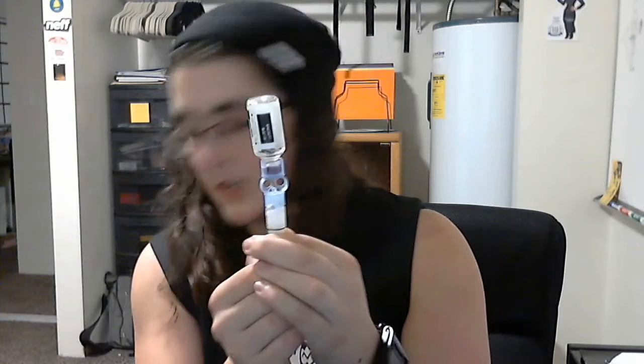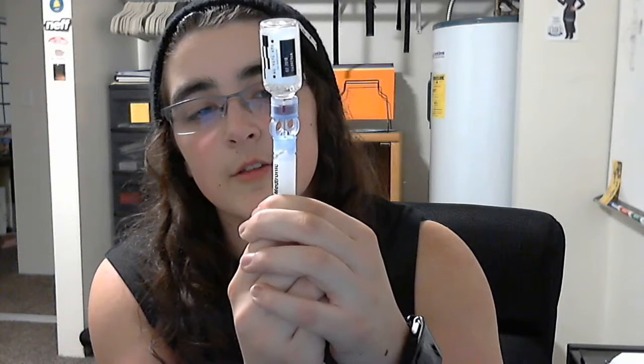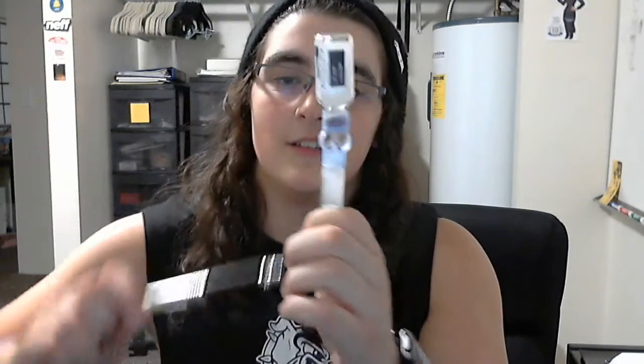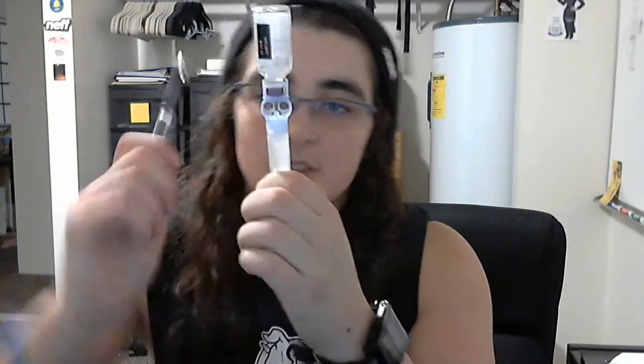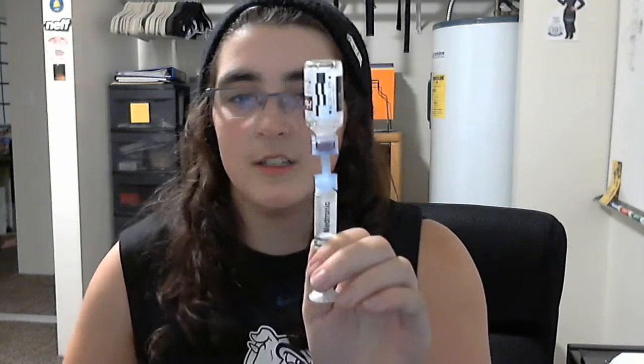I'm going to start off by putting some air in to make the fluid displace easier. So I pull out enough insulin so I get to about 3 milliliters. I have a nice bubble at the top, so I'm going to take a pen and tap out all the bubbles. There's still one at the bottom. And now I have a nice drawn out reservoir full of insulin.